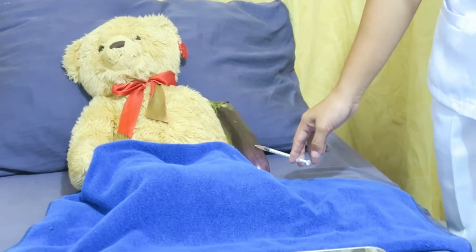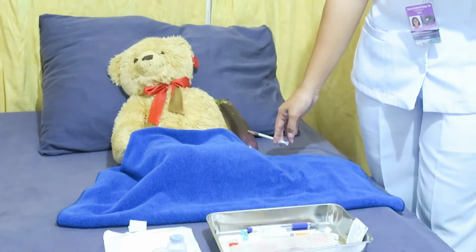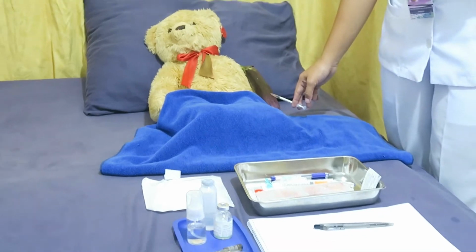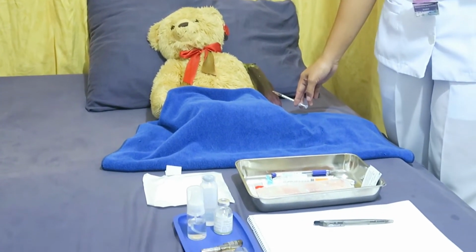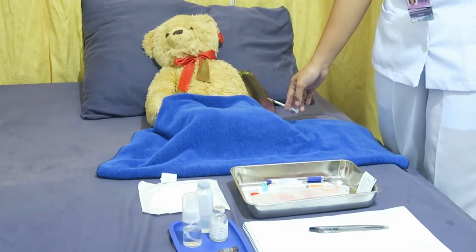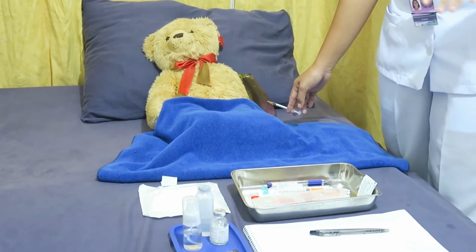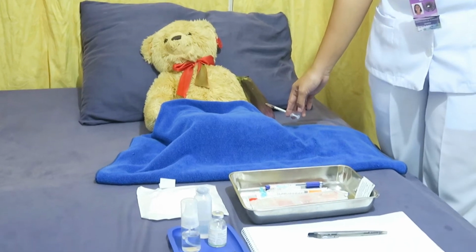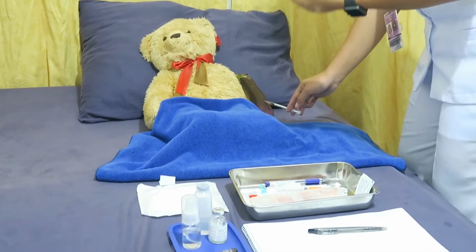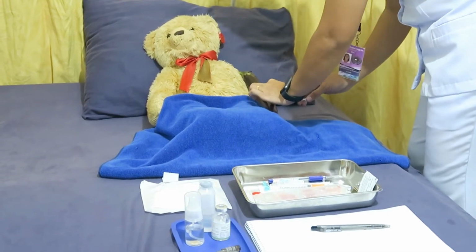So after that, withdraw the needle quickly at the same angle at which it was inserted. Activate the needle safety device. After that, apply a bandage if indicated. Do not massage the area or the sides. The rationale for that is to minimize tissue damage. And then, let's remove the needle.